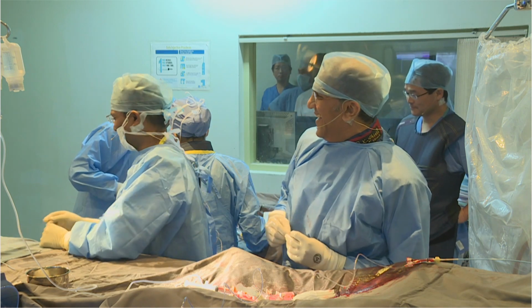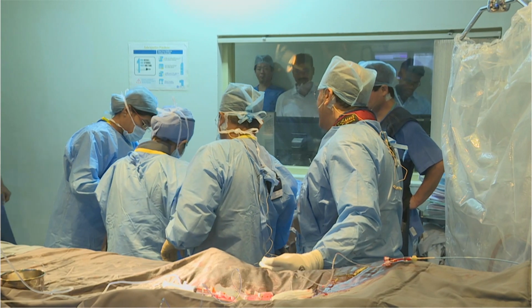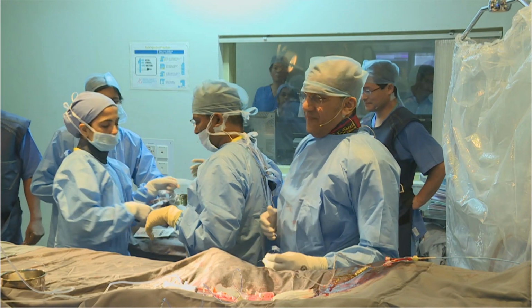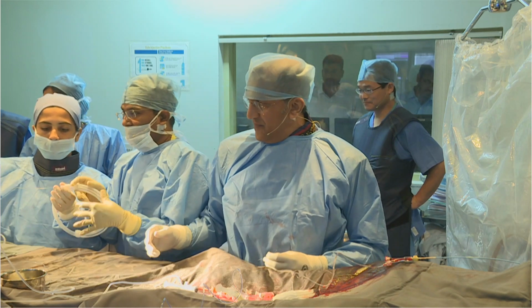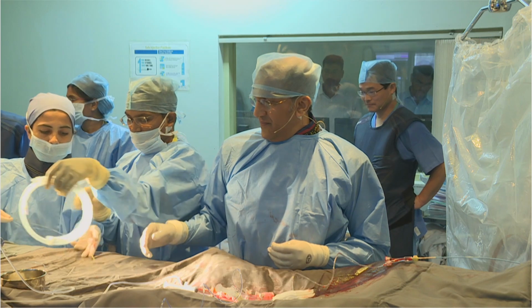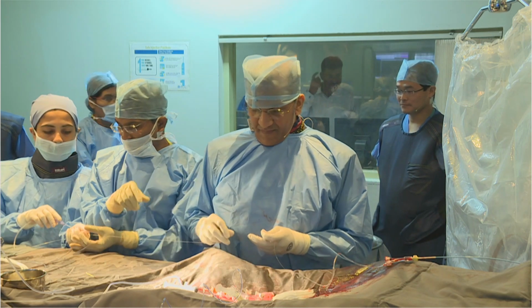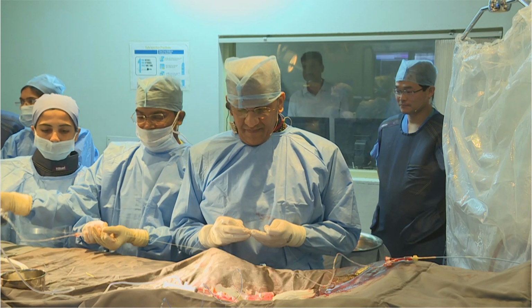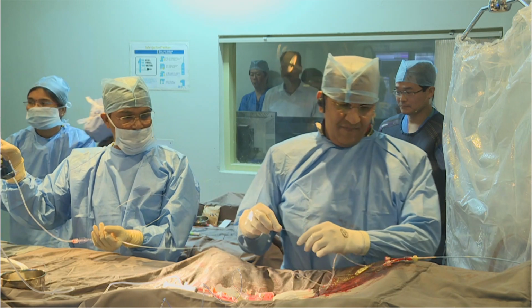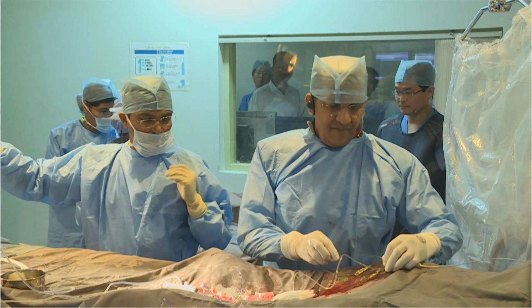Vijay. You see, start with a smaller one. There is some dent there. Start with a smaller balloon, get some way, and then things will move. The stent has been, it's a 3.5 stent which has already been opened. I agree with what you're saying, but it's an NC balloon. No, listen, there is some dent there.